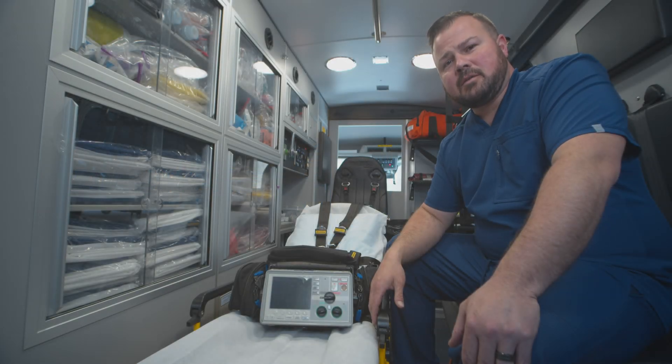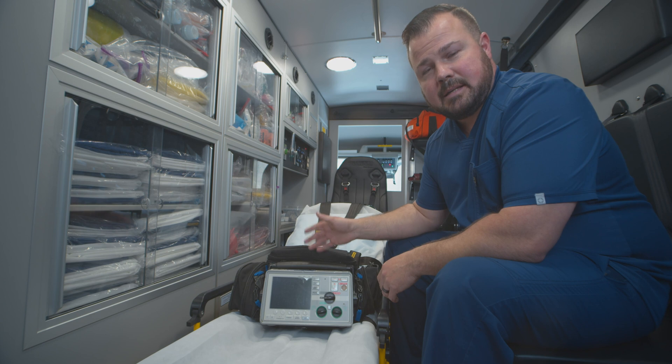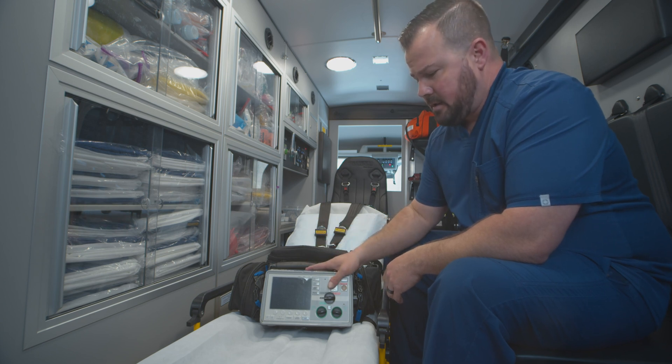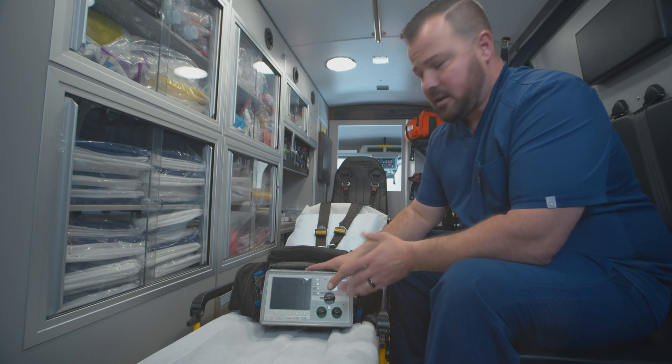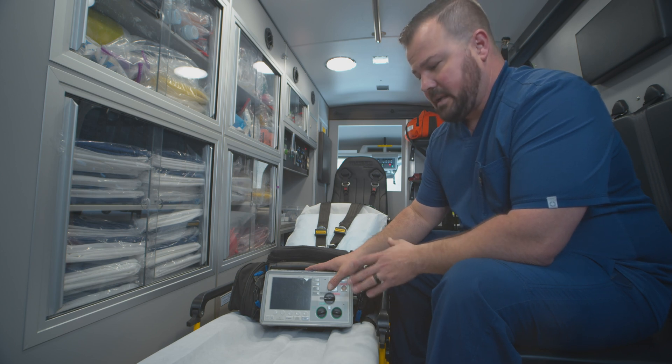Hi, my name is Wes Werner. I'm a Lieutenant RN and Field Training Officer for Advantage Ambulance. We're going to be going over the Zoll E-Series Cardiac Monitor, just some of the functions of it, how to change through some stuff, some basic stuff. It's pretty straightforward and easy to work with.